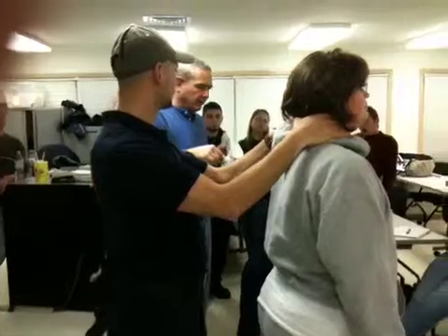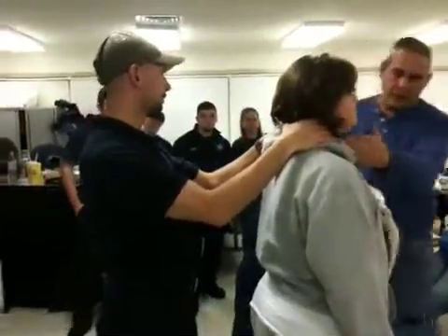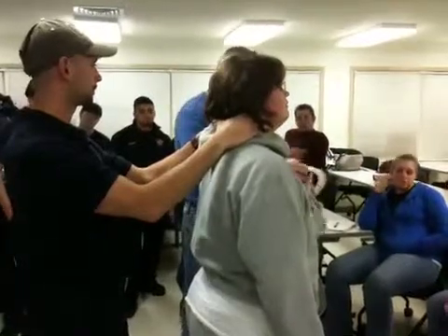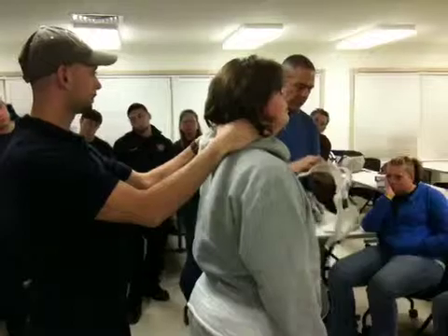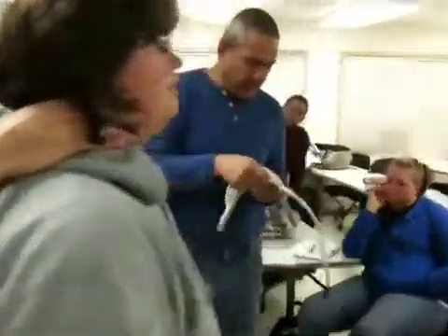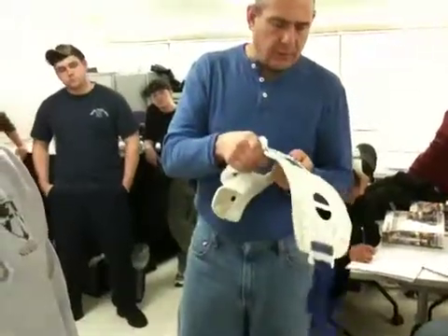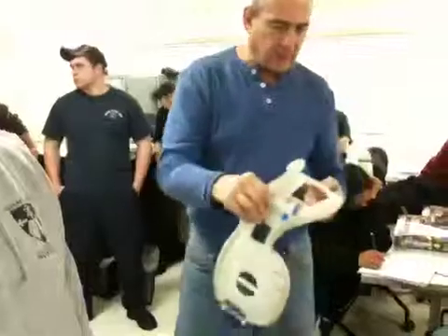Now, the proper way to measure for a cervical collar is from the clavicle to the bottom of the mandible. So she's about 4 fingers. This is just comfort. These are adjustable here, so I can adjust it to any size I like. It will adjust. So that's where my measurement was, so that's where I'm going to put it, and they just lock in place.